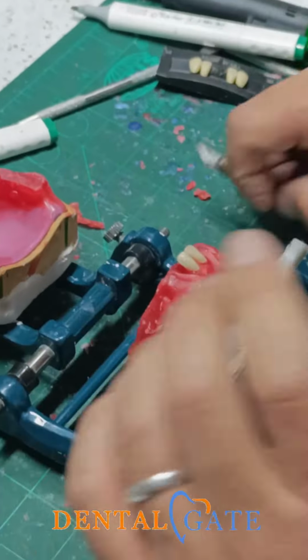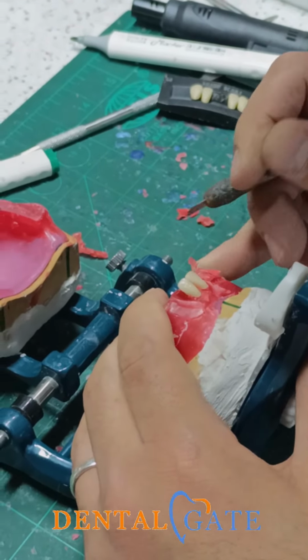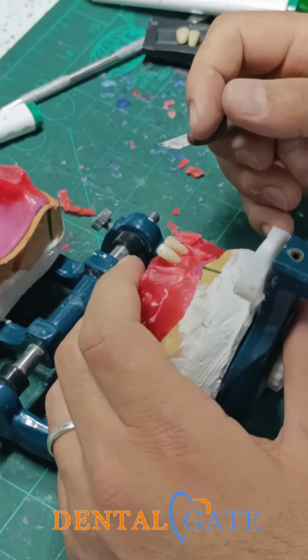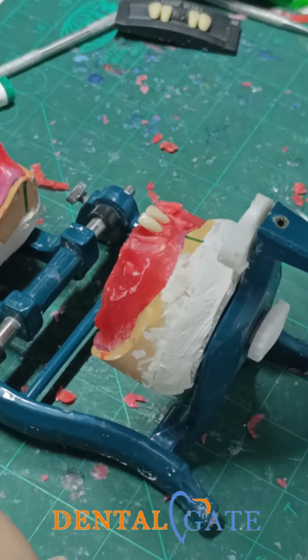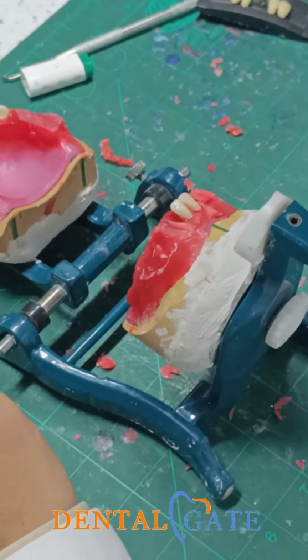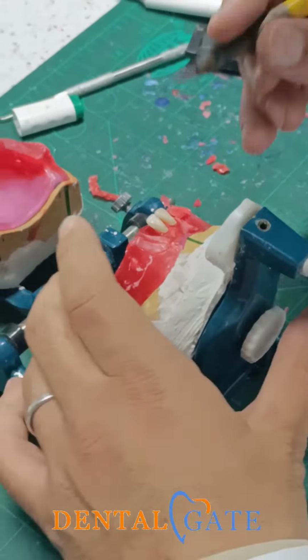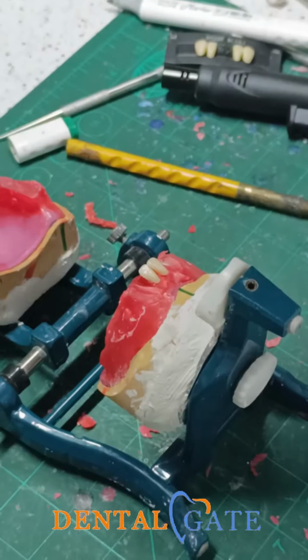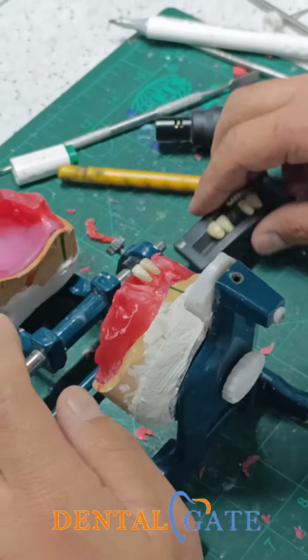So regarding the lateral incisor, one criterion says it should exceed the lower bite, but you don't need it because we already had a criterion in the upper. You can make one only, okay? When you make the upper, pay attention to the overlap and the overjet. It's the same, regarding the overjet and the overbite.